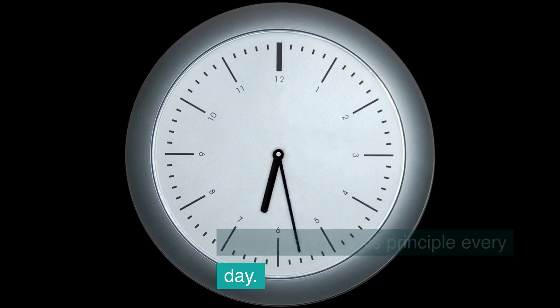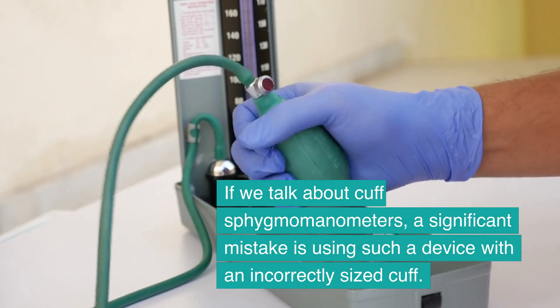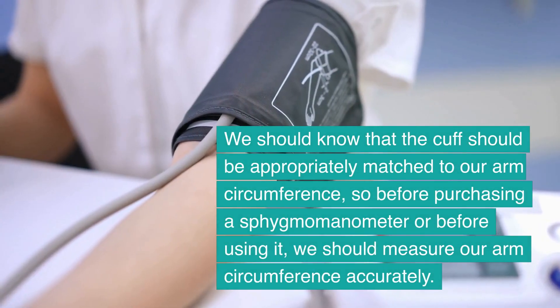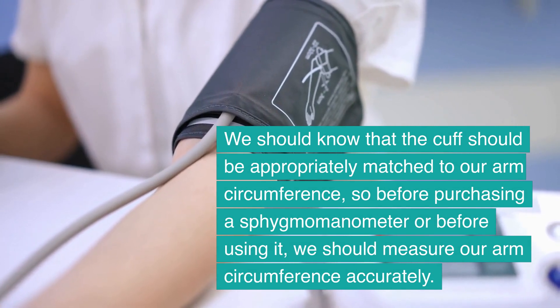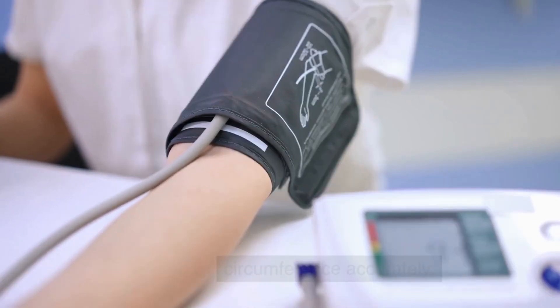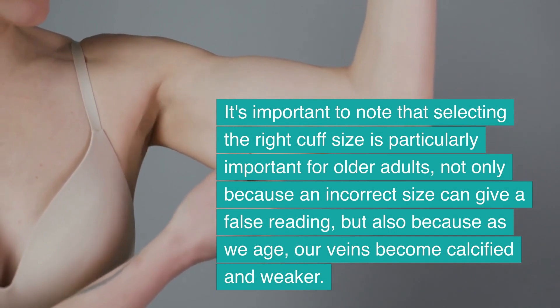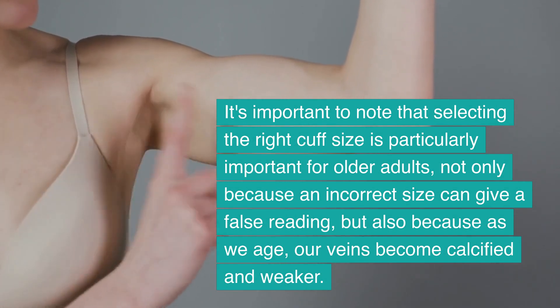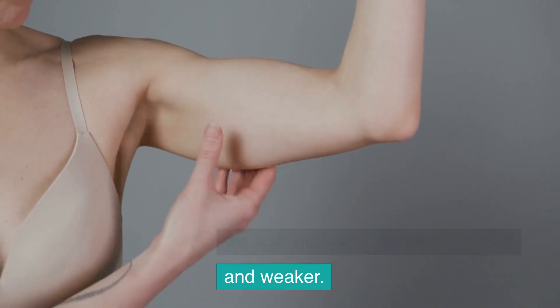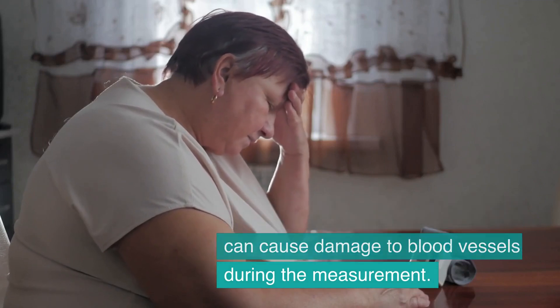When using cuff sphygmomanometers, a significant mistake is using a device with an incorrectly sized cuff. The cuff should be appropriately matched to our arm circumference, so before purchasing or using a sphygmomanometer, we should measure our arm circumference accurately. Selecting the right cuff size is particularly important for older adults — not only because an incorrect size can give a false reading, but also because as we age our veins become calcified and weaker, and an improperly fitted cuff can cause damage to blood vessels during measurement.